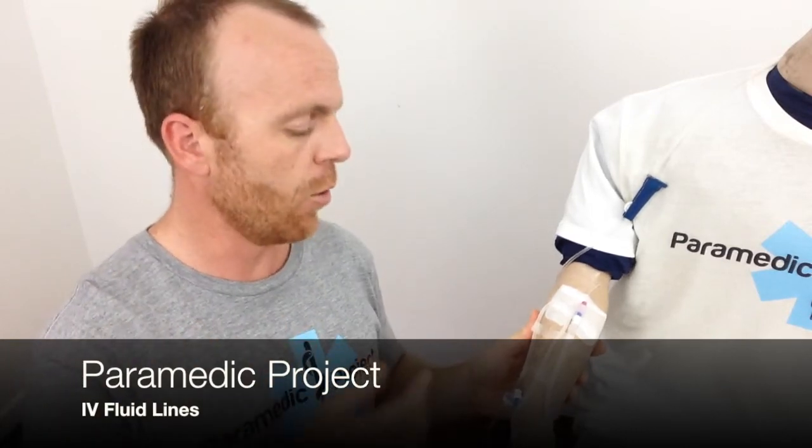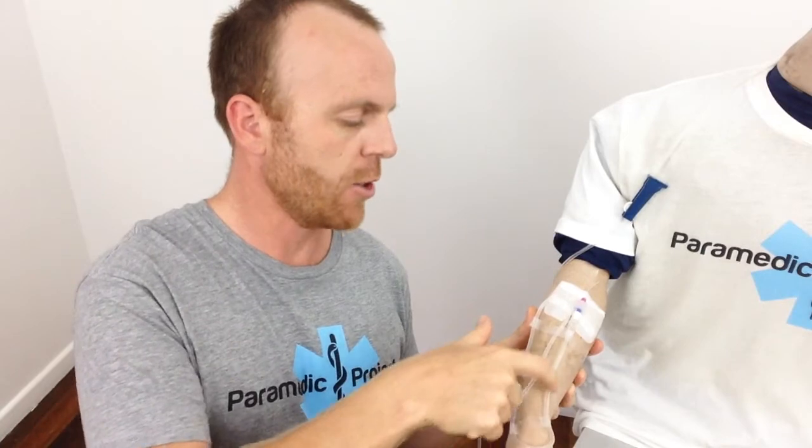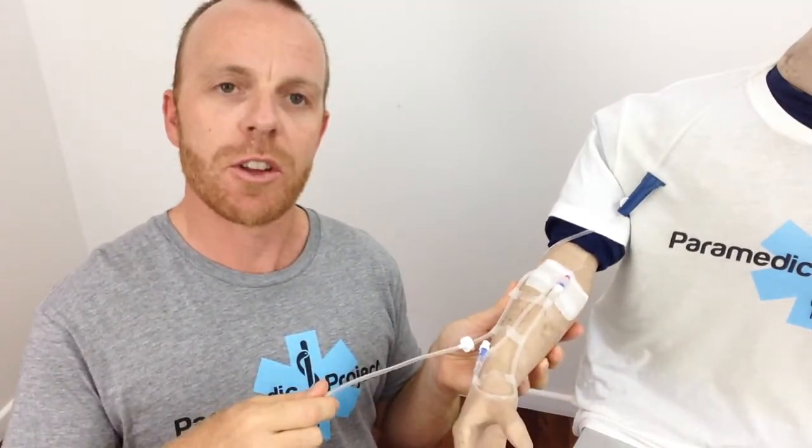Let's look at what I've done here. First of all, you'll note that there are two or three loops of actual IV fluid line before we reach our IV cannula. This just means there's a whole lot of slack there in case this hose catches on something — one of those loops can pull away and we'll still maintain a patent IV access.